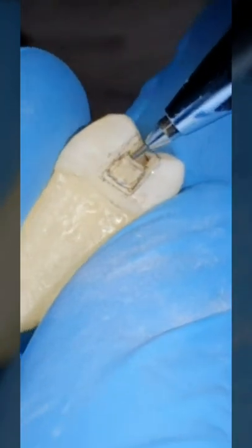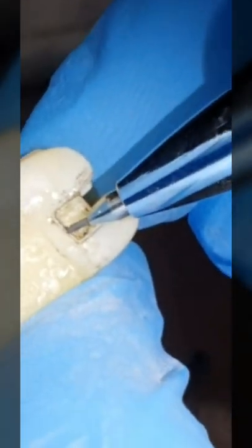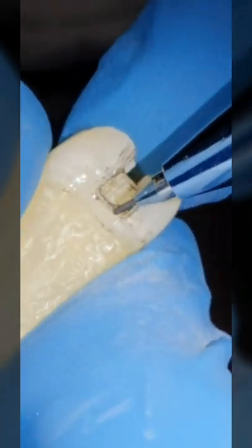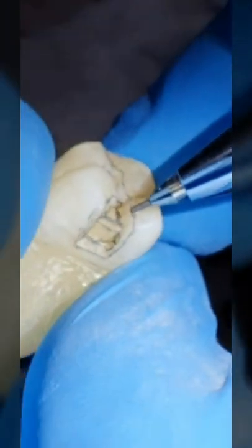For me to convert it into an inlay or an onlay, I'm going to go ahead and make the walls divergent as they come occlusally. That means this space right here has to be wider than this space right here, and the angulation has to be in line with the walls right here. I will leave the bevel right there. That will help in cementation later, and this margin has to be sloping apically as it exits the cavo surface. So I'll go ahead and make those modifications, then show you as an inlay.